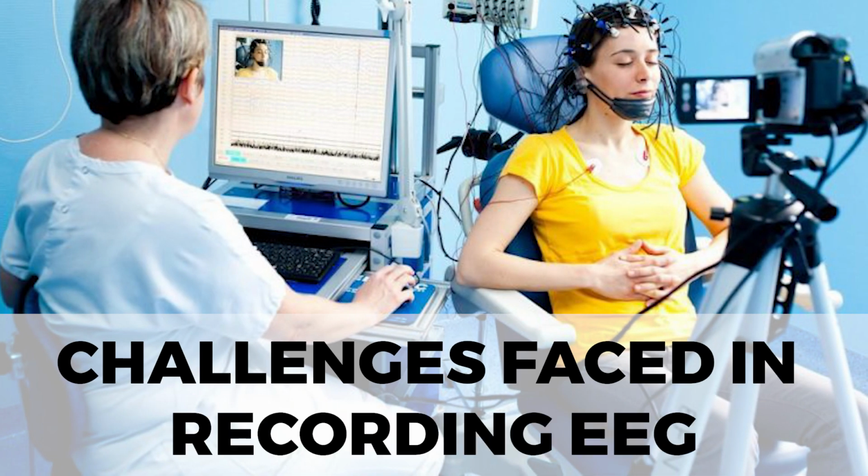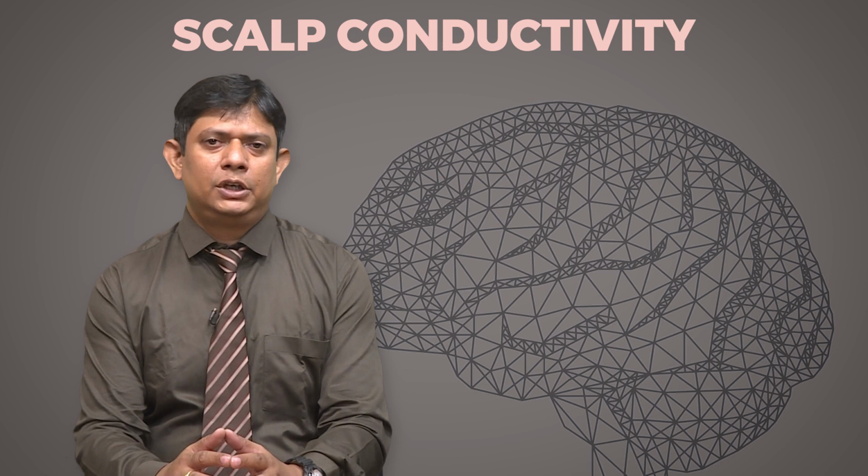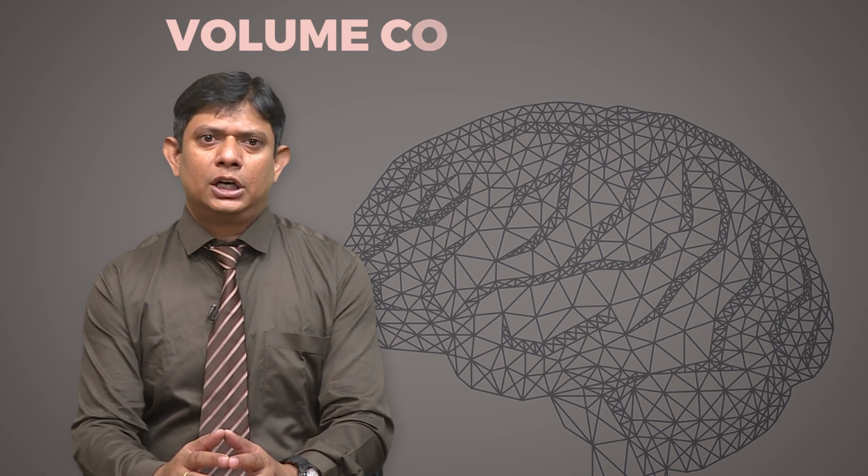Now, the challenges and considerations we face while recording EEGs. First is scalp conductivity. The conductivity of the scalp, skull, and brain tissues influences the propagation of the electrical signal. The skull acts as a barrier, distorting and attenuating the signal. Different tissues have different resistance, affecting the recorded signal quality. Volume conduction. Electrical signals generated by the neurons spread across the brain and conduct through the surrounding tissues. As a result, the signal recorded at a specific scalp electrode represents the summation of the activities of various brain regions.